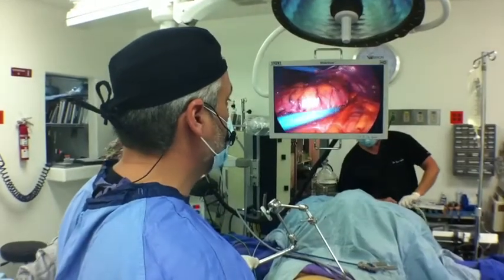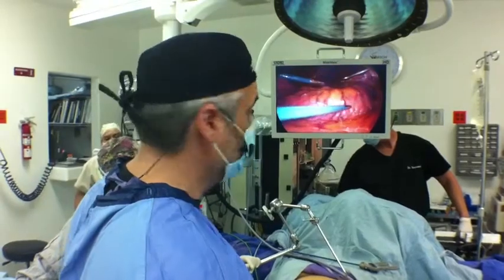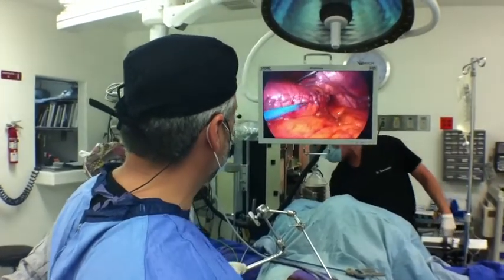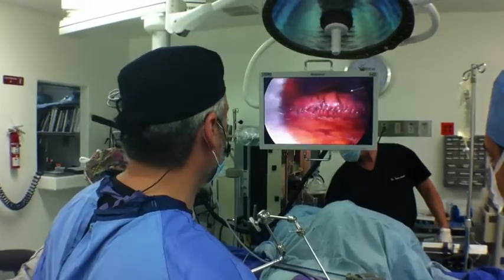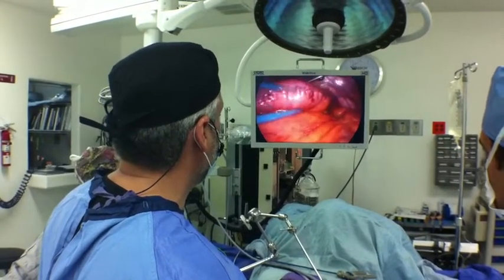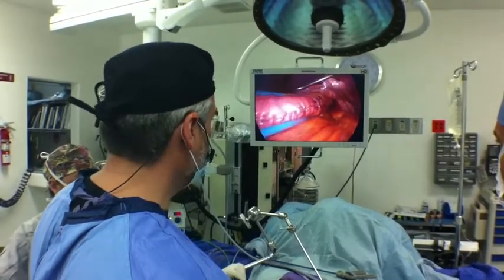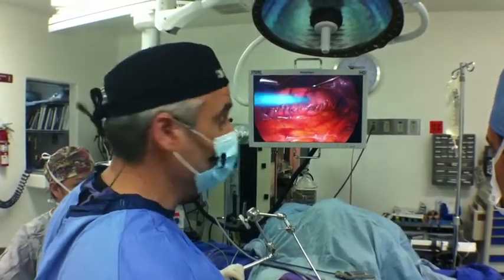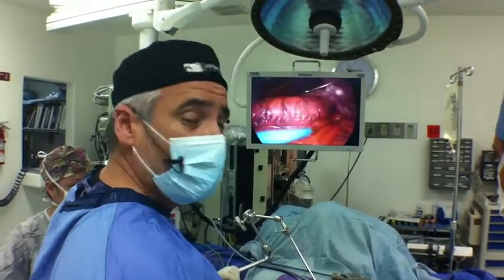As you can see, this is the end result of the gastric plication. This is a beautifully symmetrical line with no signs of blood flow restriction anywhere. It's a very small stomach, very similar to what a stable gastric sleeve looks like, with definitely the same resulting intragastric volume.